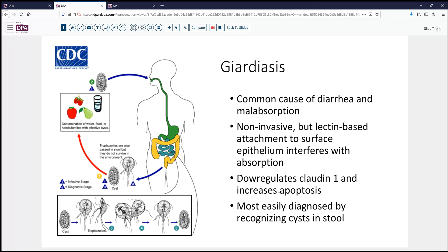They downregulate Claudin-1 and increase apoptosis, therefore potentially increasing turnover. Certainly, small bowel biopsy is not the most common way to diagnose this — much more commonly it's detected in stool samples. But if they're moderate in number, or if the clinician has failed to order that test, the endoscopy biopsy and the pathologist will be the way to make the diagnosis.